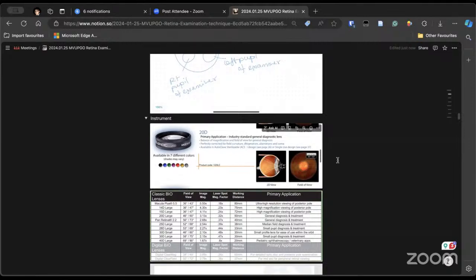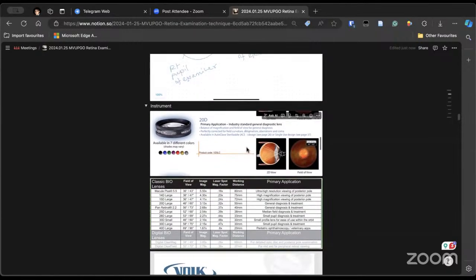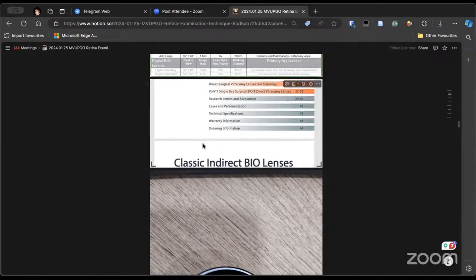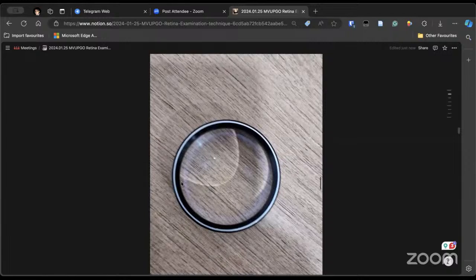So this is the most commonly used, and which is the other lens which is used for ROP? For ROP, which lens is usually used? Any candidate? Retinopathy of prematurity. Yes, 20. Thanks, Doctor. So read about the Volk lens catalog. You can go to their website and see this. At least remember the parameters of the lenses which you have been using. Sir, can you tell, for ROP, what is the lens used? Plus 28 diopter lens. Okay, thank you, sir.